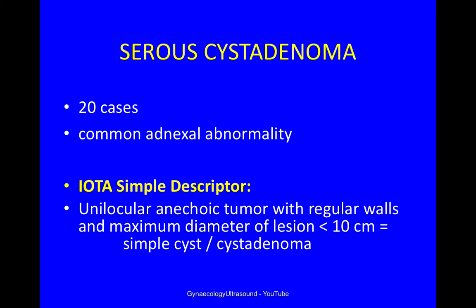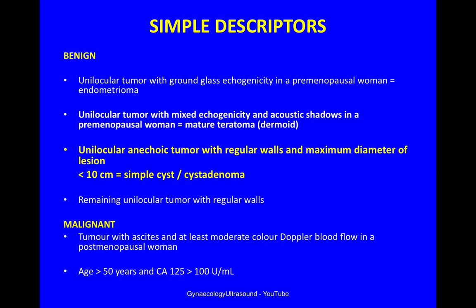When you first see a cyst like this, you might immediately know it's likely to be a serous cystadenoma as it fits one of the IOTA simple descriptors. A unilocular anechoic tumour with regular walls and maximum diameter of less than 10cm is likely to be a simple cyst or cystadenoma. There are 4 benign descriptors and 2 malignant descriptors.